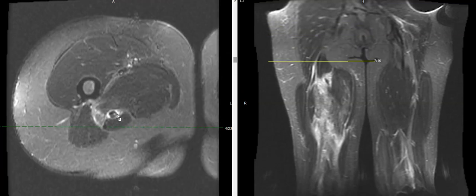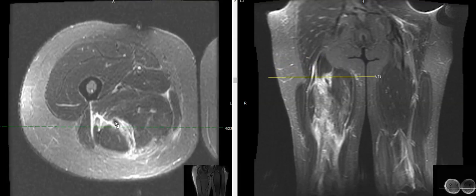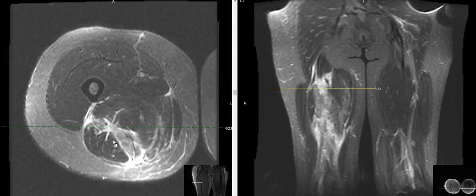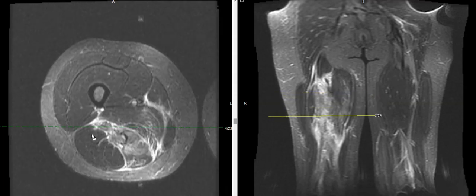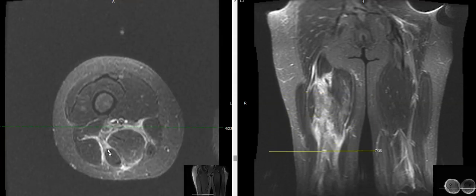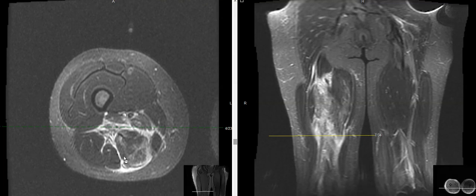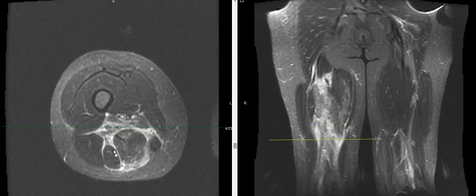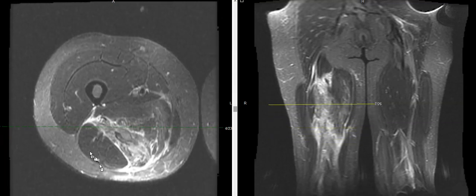As we come down further, this is the semimembranosus. We're going to follow that down — there's the black tendon. We can see that that is the one that's involved. The other two are right here. The biceps, as we come down further, is most lateral. This is the semitendinosus here, which is going to end kind of high and turn into a tendon. And here is the semimembranosus. This is a good example of how sometimes it's hard to tell them apart, especially up here when they look like just one muscle.